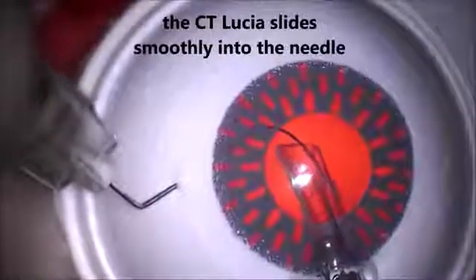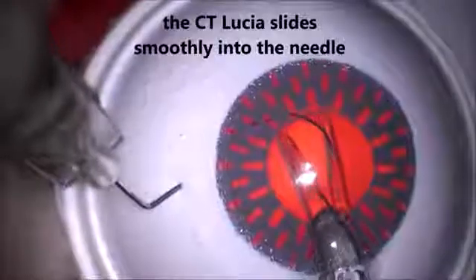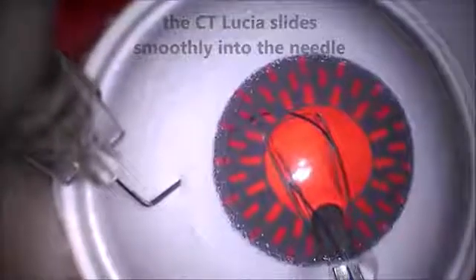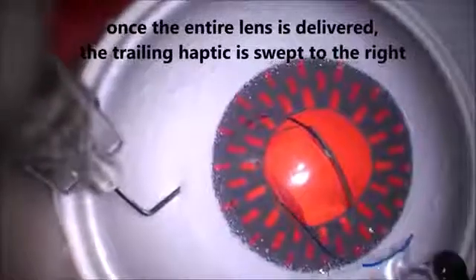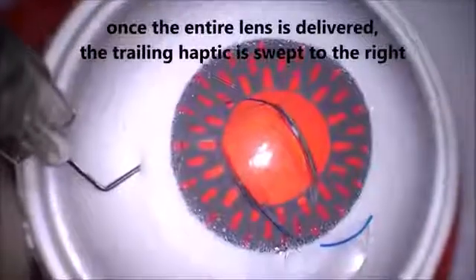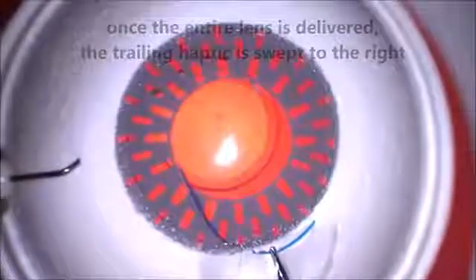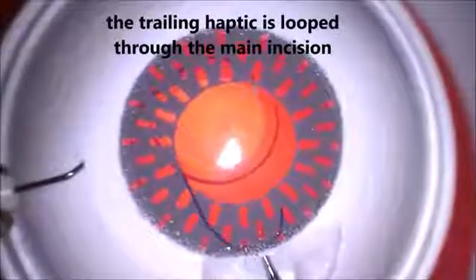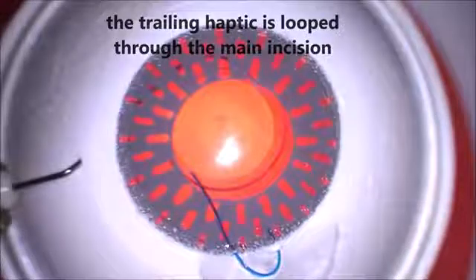Once the entire lens is delivered, make sure it's delivered with the optic in the correct orientation. Once delivered correctly, sweep that trailing haptic to the right. I'm still holding the syringe and needle with my left hand while the right hand has fully delivered the lens. The trailing haptic is swept to the right. Then disengage the syringe from the needle with a hemostat — hold the needle carefully as you do this. Then take the trailing haptic and loop it in the incision.